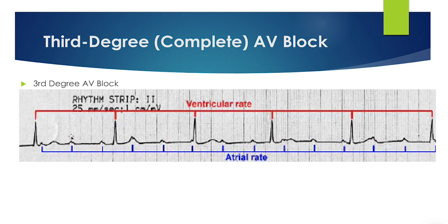So we can see here that the QRS complexes are normal width, and they are moving at the same rate together. The distance between the QRSs is the same, it's not changing. And then the P waves are also the same here and not changing. And sometimes you might have an underlying sinus arrhythmia.